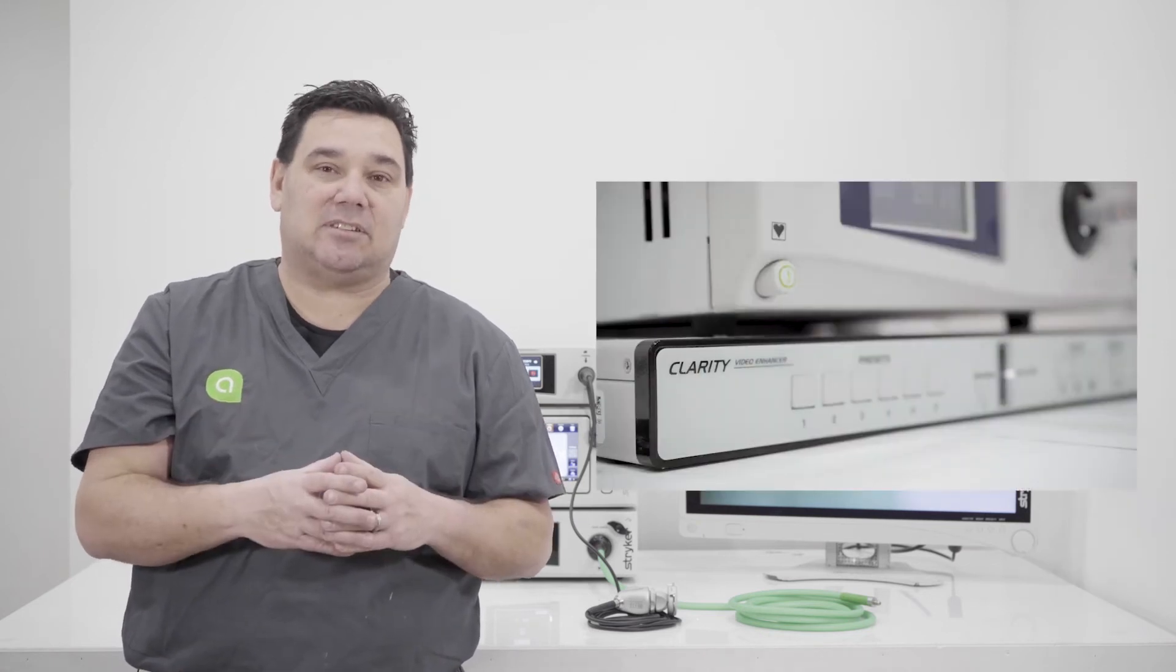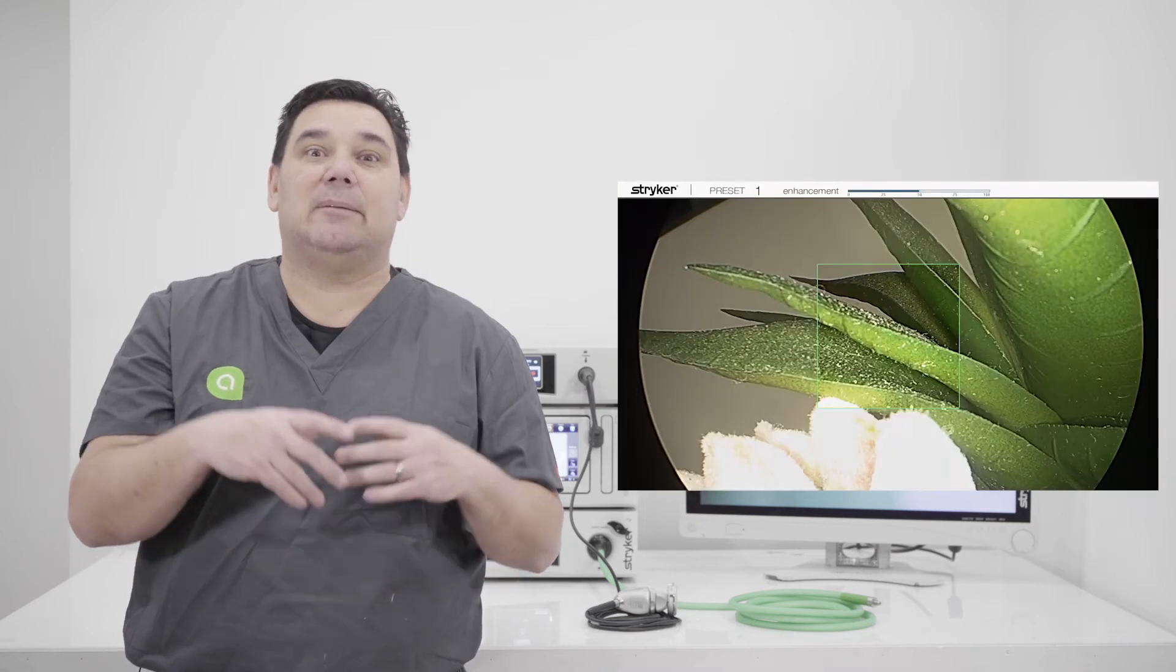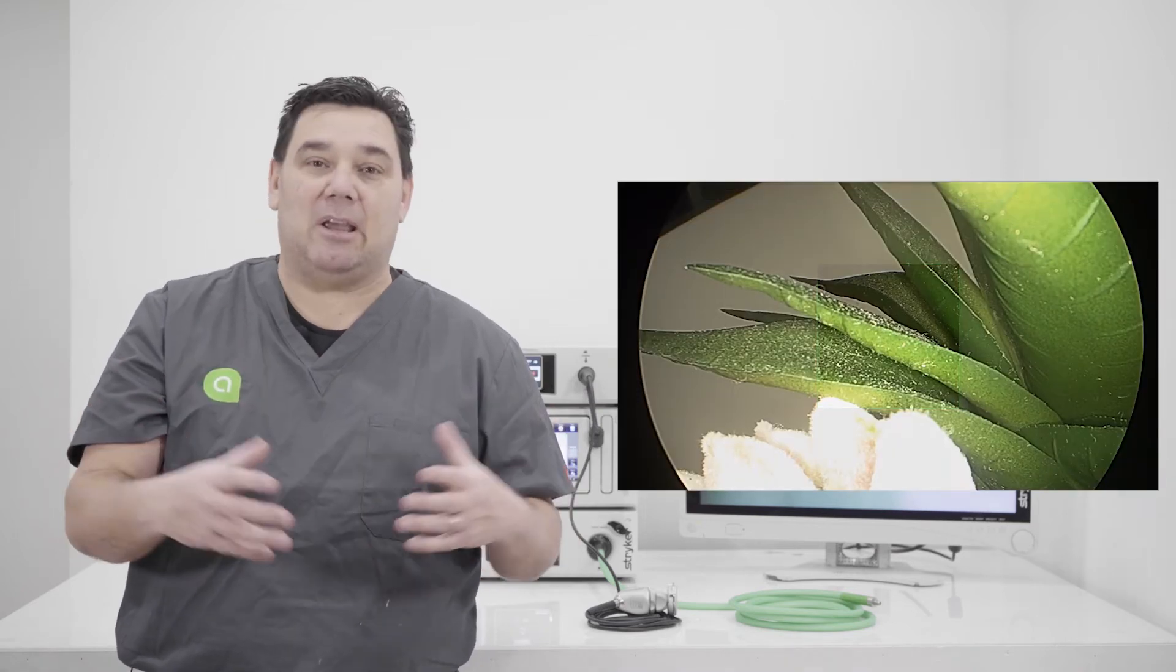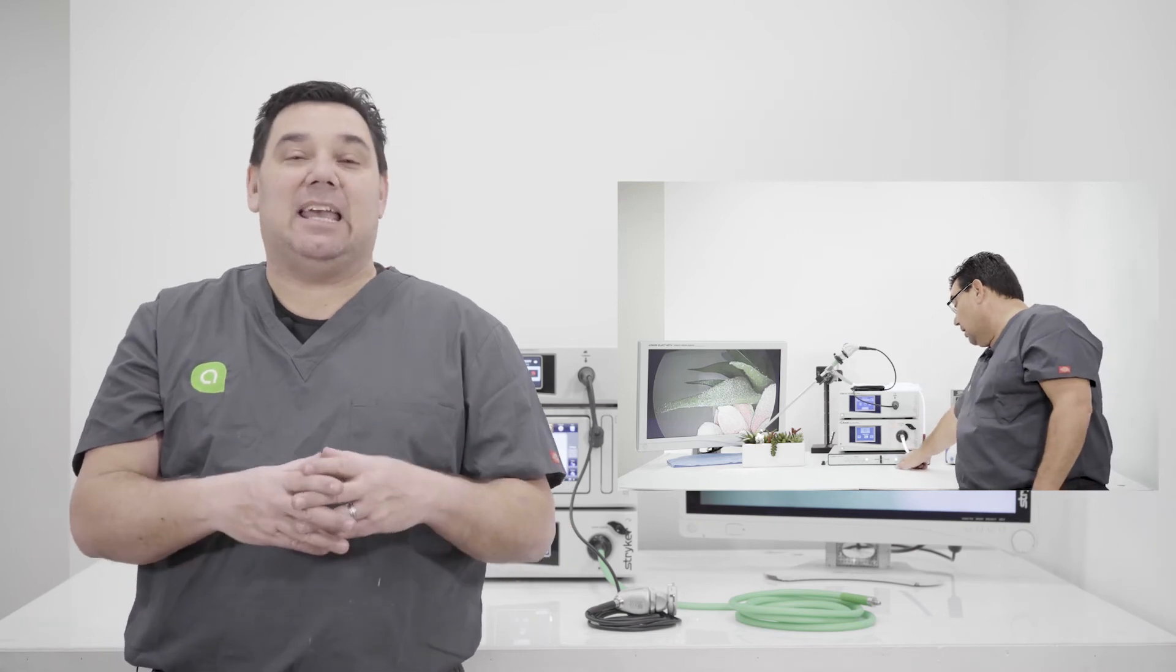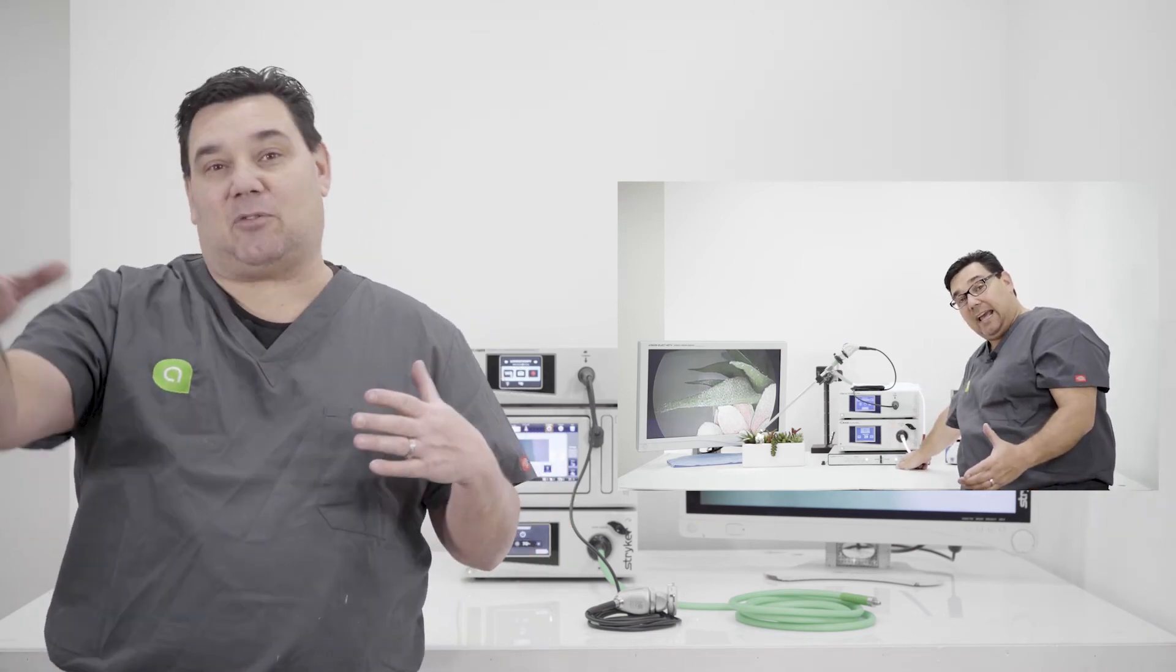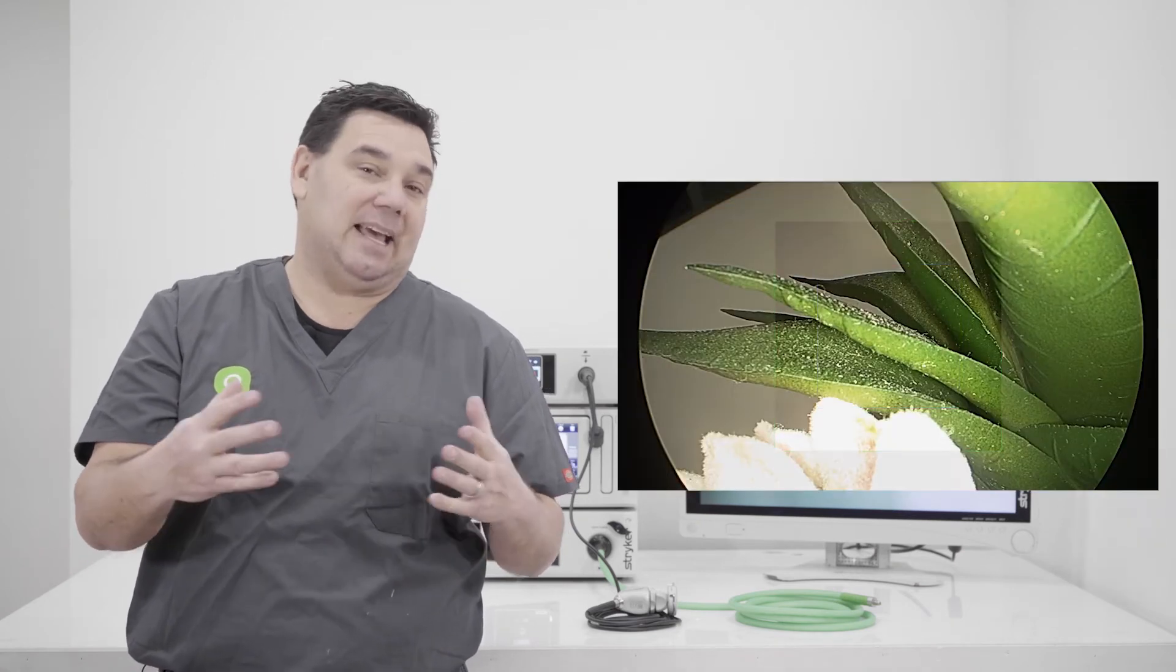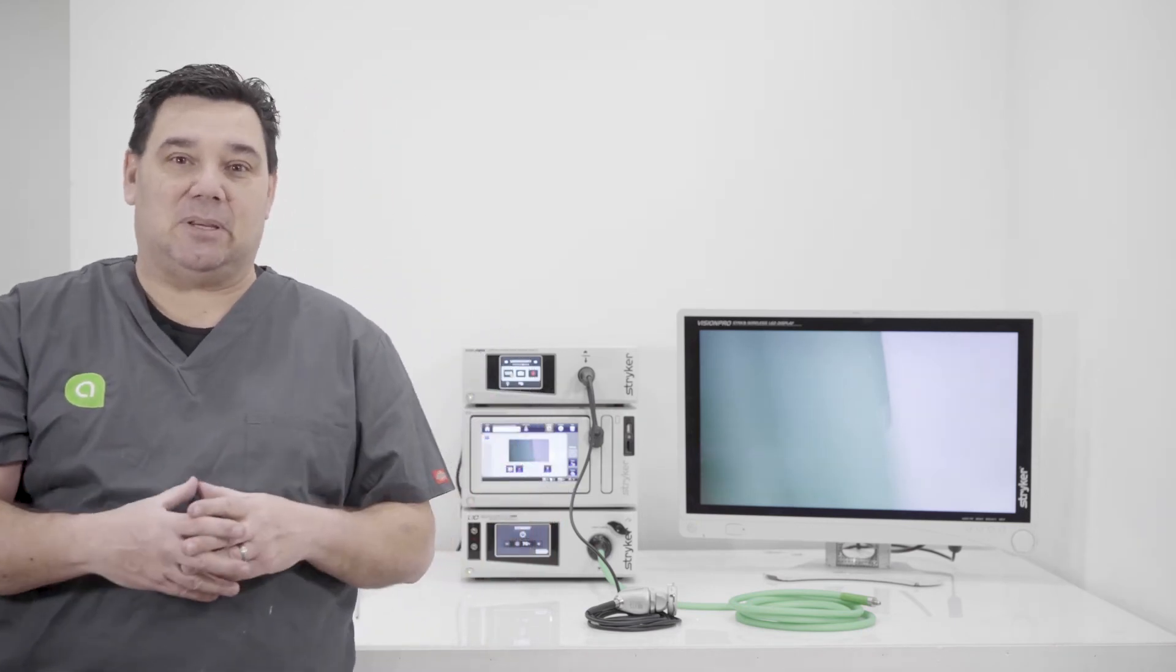One of the devices that you can add on in a video platform would be the clarity system. So basically Stryker has made the clarity system to be able to enhance or digitally enhance video. That's what the device does. That's its sole purpose. It grabs a video signal and it transfers it or outputs it to your display. So again, it's a clarity digital enhancement system. And that's a device when you talk about laparoscopy.